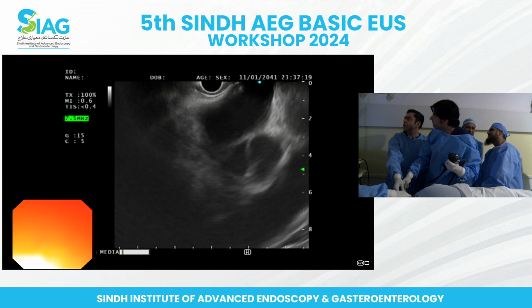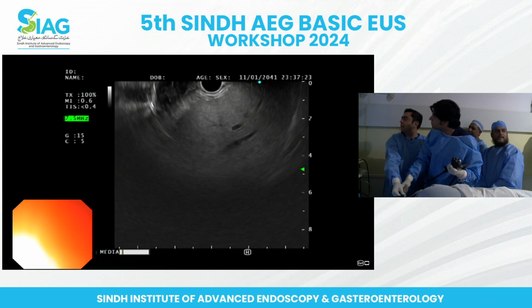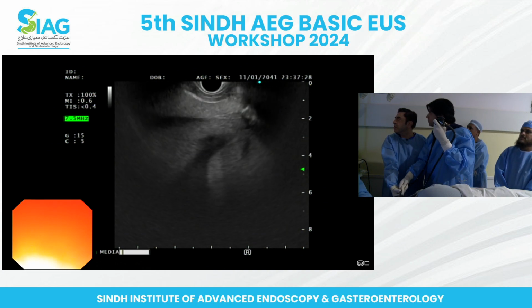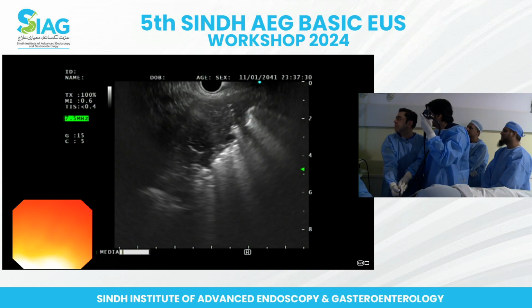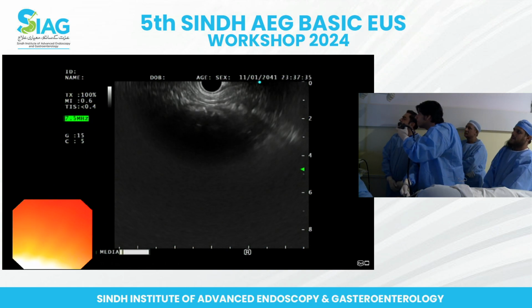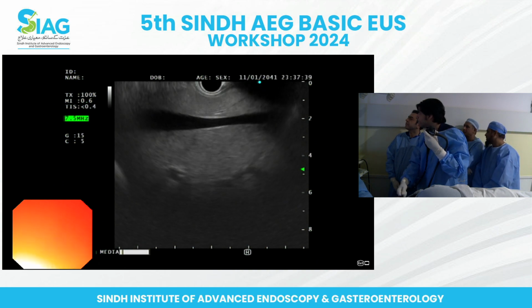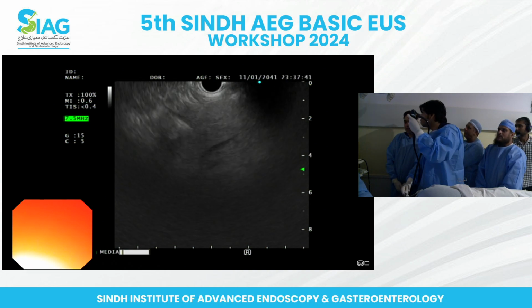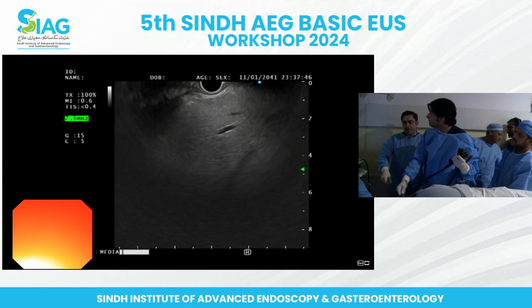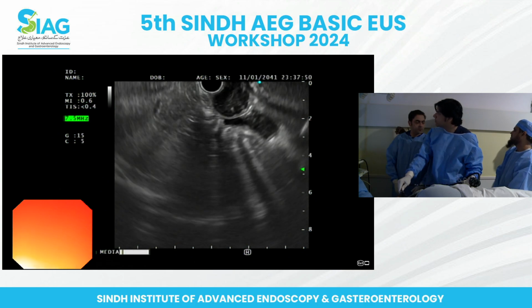So now you know that you are quite up because you can see the heart. So you can push it down slightly, and then now you can turn it around just clockwise motion, and you should be able to go around that bit. So see if you can find the aorta again. So you are on the liver, excellent. So go back. Have you turned around 360? I think you just go back all the way. Okay, excellent.